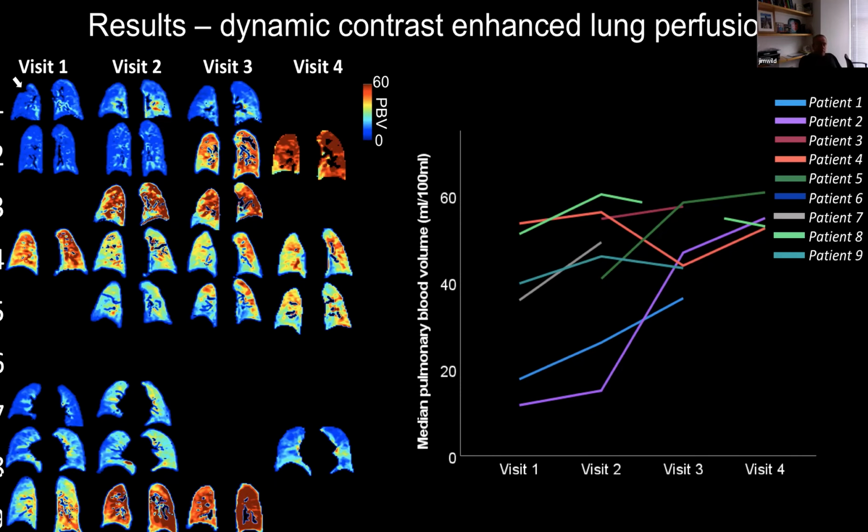What's interesting from these perfusion maps is there are no clear-cut classical wedge-shaped perfusion defects that you would perhaps see in thromboembolic disease, chronic thromboembolic disease. So what we're looking at here is not a large blood clot in one of the main blood vessels. It's a more diffuse capillary perfusion abnormality consistent with a shunting of the arterioles and venules.